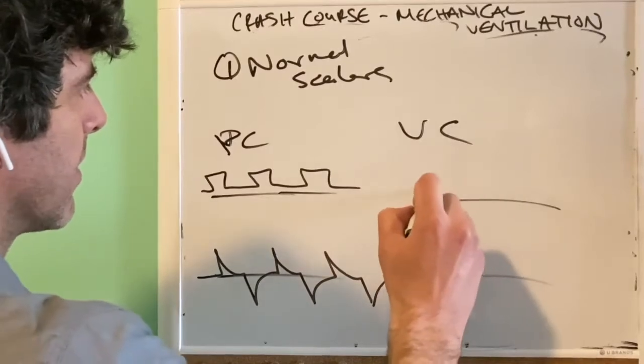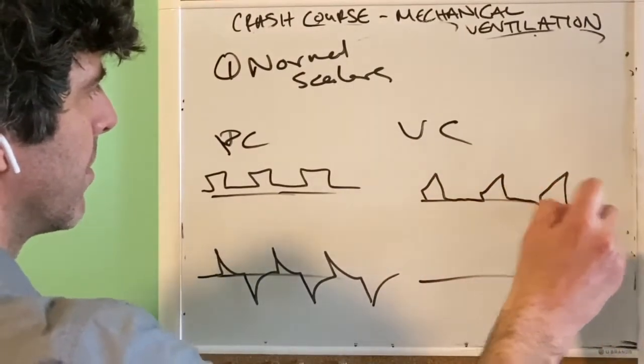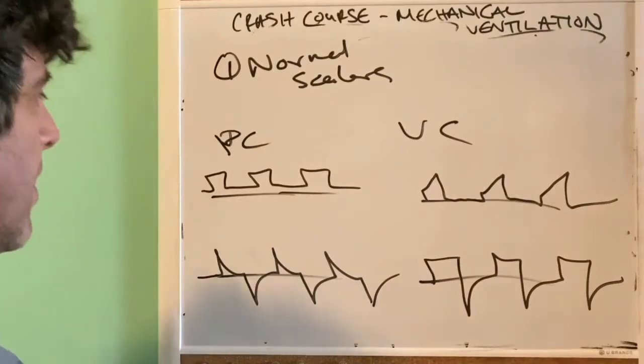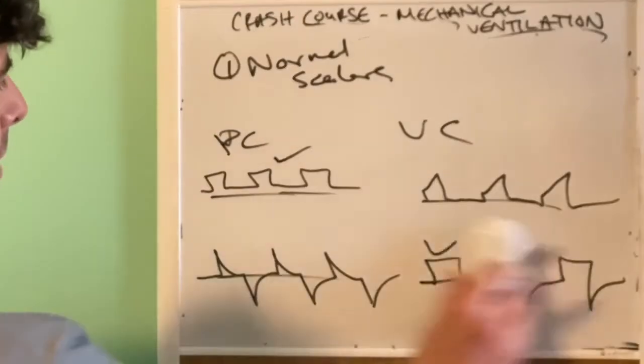All right? Same thing. This one has no PEEP, which you can always set to 0. Sorry, I should have drawn this one first, all right? It's always good to draw the independent ones, which are this and this, all right?